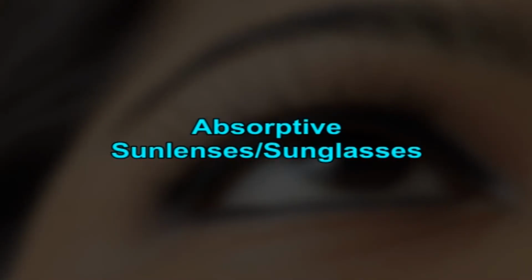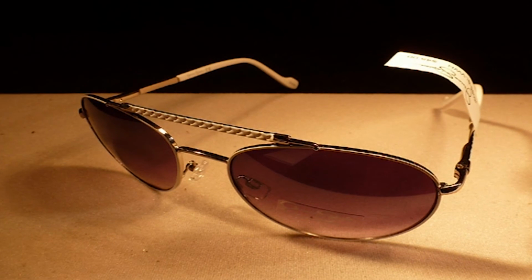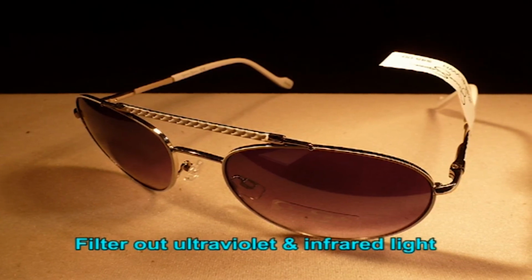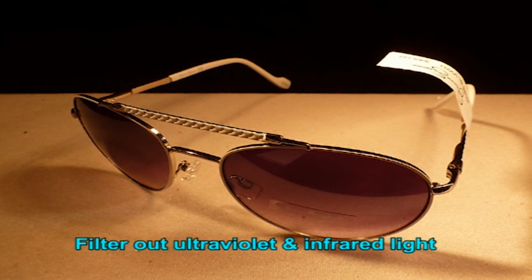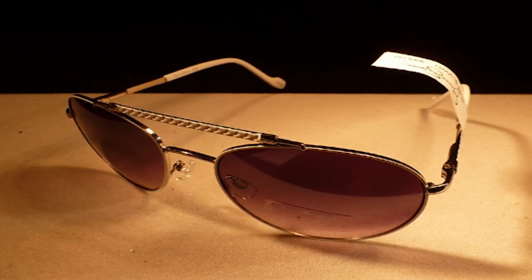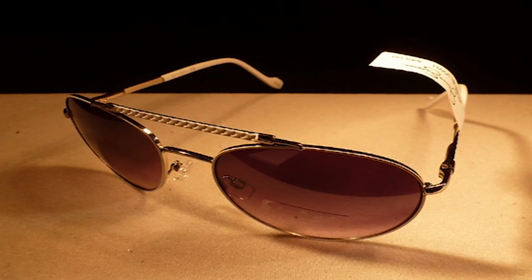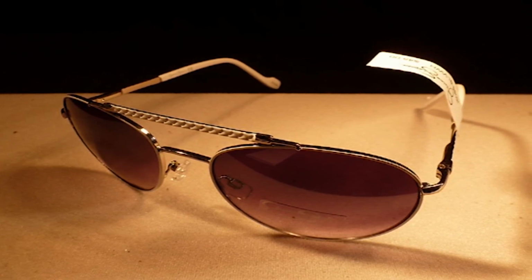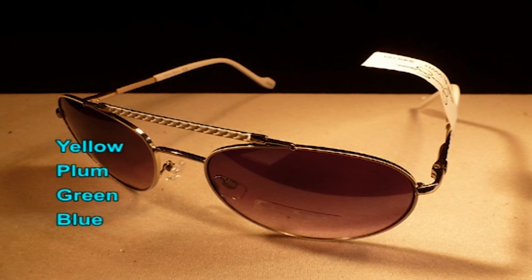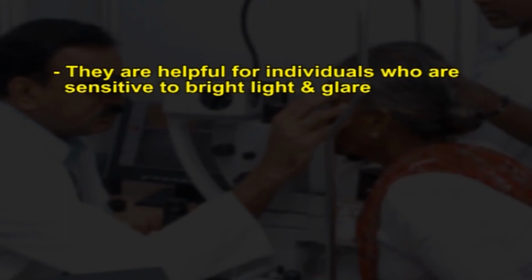Absorptive sun lenses or sunglasses. Absorptive lenses are special wraparound sunglasses that filter out ultraviolet and infrared light. The range of tints, tints means a shade or variety of color which reduces glare, includes yellow, plum, green, blue and brown. They are helpful for individuals who are sensitive to bright light and glare.